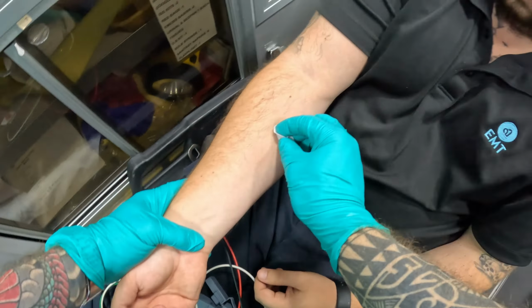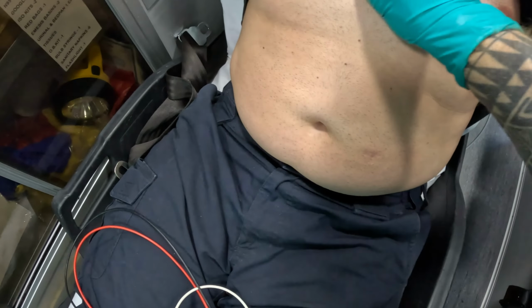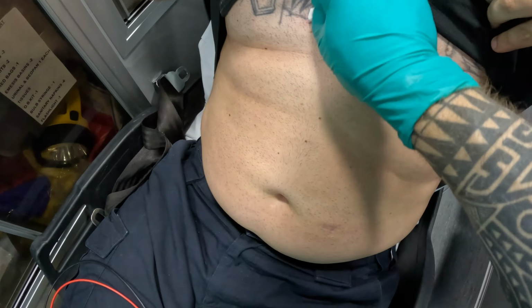And then can you lift up your shirt for me, sir? Right, so we're going to clean here and around here. If the patient had a lot of chest hair, you may need to essentially trim it or cut it, right? I would say, before you do that, talk to the medic and the nursing staff, right? So it cleans around the chest. Just keep holding your shirt for me.